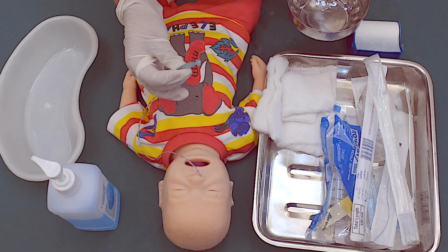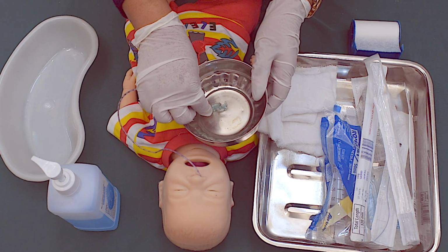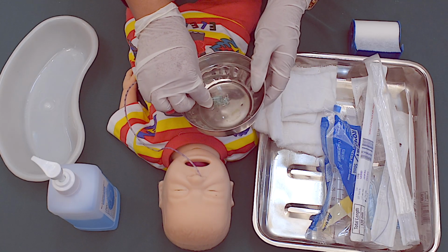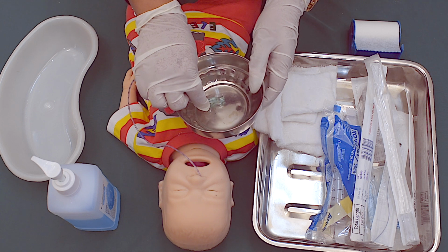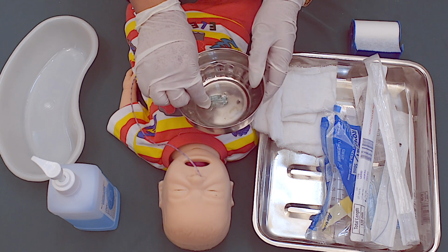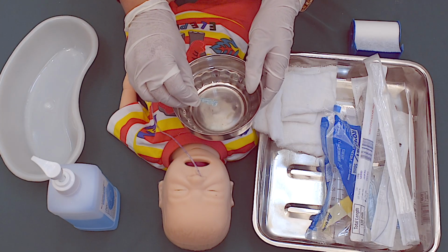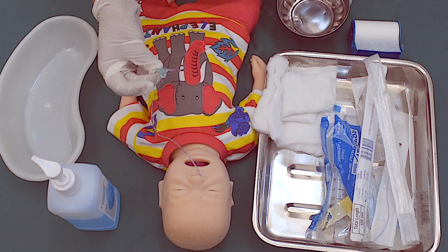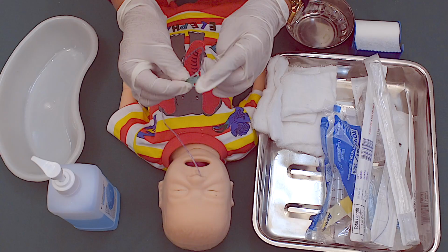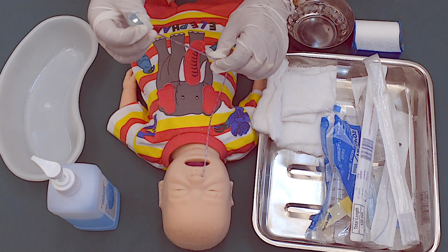If the tube is in the stomach, there will be hardly 1 or 2 bubbles coming out if we dip the tip of the tube in a bowl of water. If we see a gush of air bubbles coming out through the tube, that means the tube is in the trachea and this tube is to be pulled out immediately. Clamp the tube and close it. This tube is in the stomach.